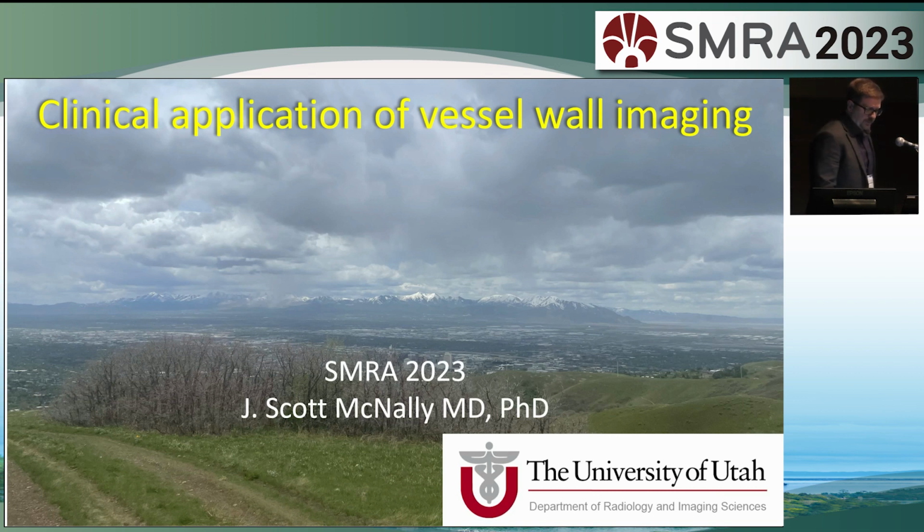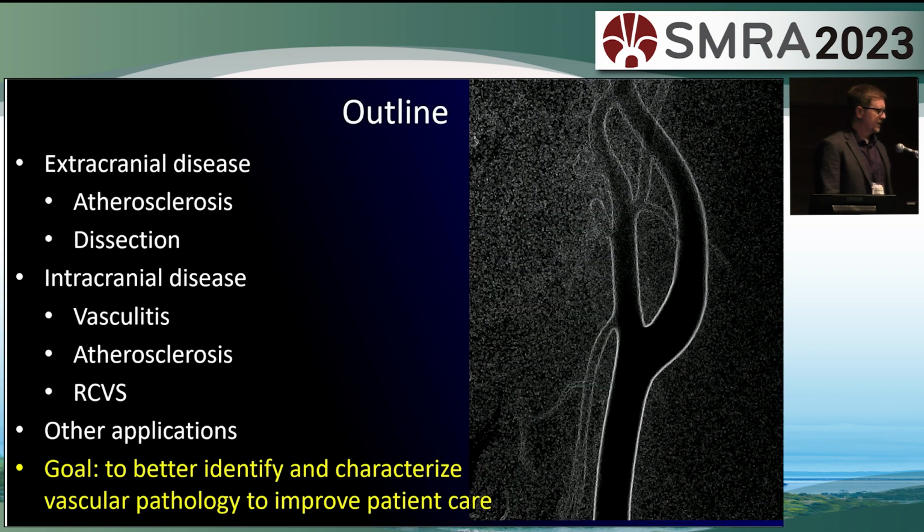Thank you very much for the invitation. I'll be talking about clinical applications of vessel wall imaging. We'll begin by talking about extracranial disease, move on to intracranial disease and some other applications. And the goal of this is to better identify and characterize vascular pathology and basically improve patient care.